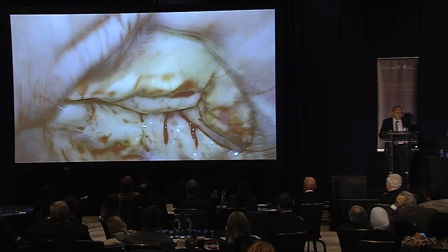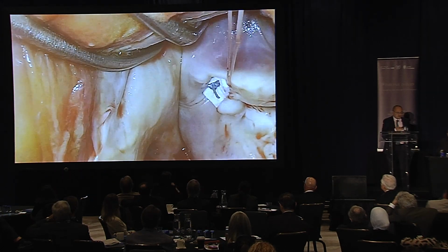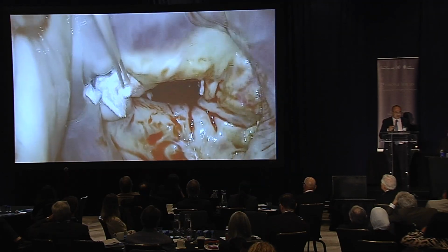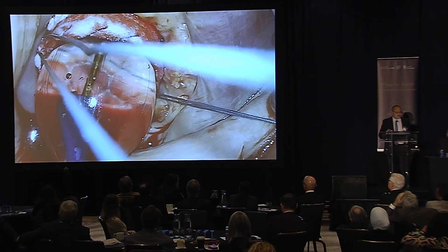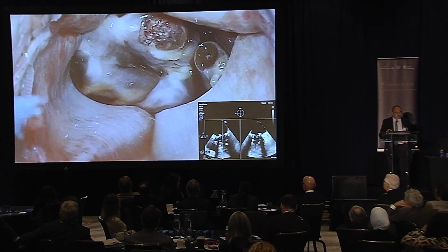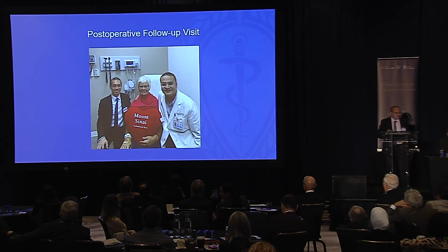Bad case. You take the patient to the OR, valve analysis almost identical to the CT scan. Again, very circumferential, thick. The anterior leaflet is spared. We closed the open commissure because that can be a site of paravalvular leak, and we resected the anterior leaflet to avoid LVOT obstruction, which we know is the Achilles heel of this procedure. We wrap these valves in felt, and then we deploy them. We add some sutures if possible, and then you see the echo, very well-seated valve, no outflow obstruction, no MR. You wouldn't even tell this was a SAPIEN valve if you didn't know about it by looking at the echo.